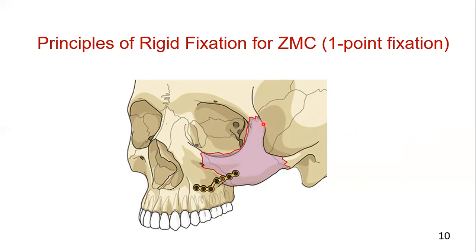You will not see any separation of this area, and with good intraoperative visualization and reduction of the lateral maxillary buttress and infraorbital rim, 1 point fixation with a plate between the maxilla and the zygoma may be adequate. Apart from the maxillary vestibular approach, you can use an existing laceration for the surgical access.